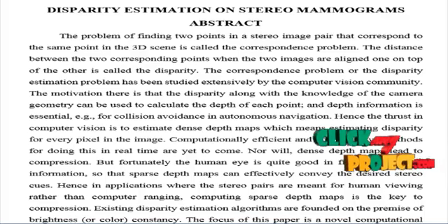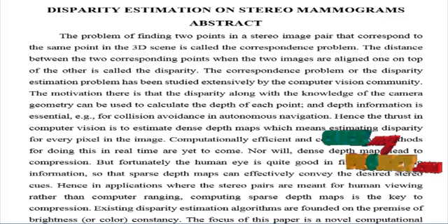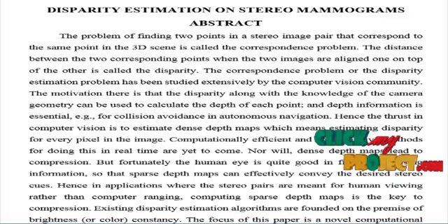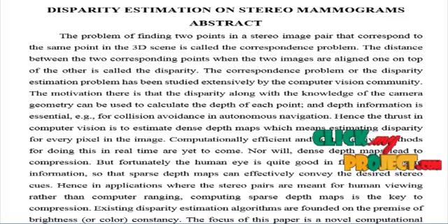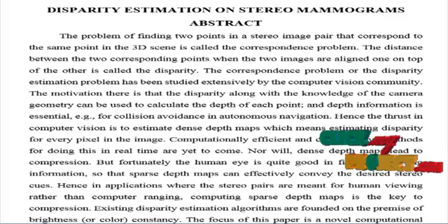The production of stereo maps based on the combination of different views of images is helpful in the identification and registration of the images. Stereo image pairs were obtained from the datasets. The first image is chosen as the reference image. An initial estimate of the depth map is provided. The weightage values were obtained from the reference frames.